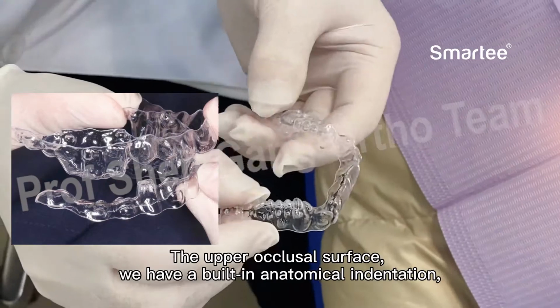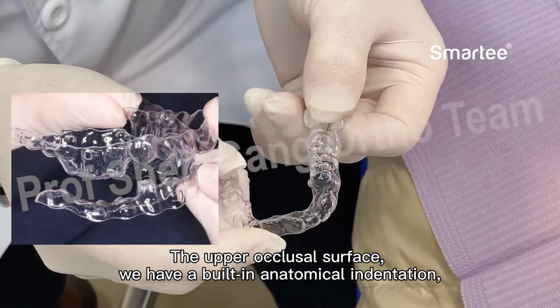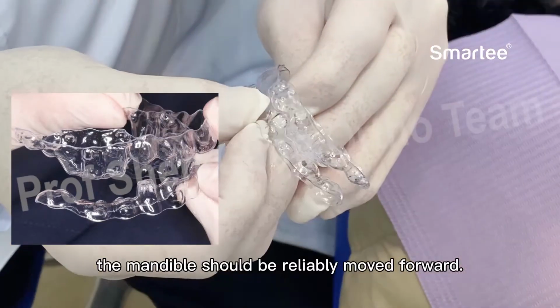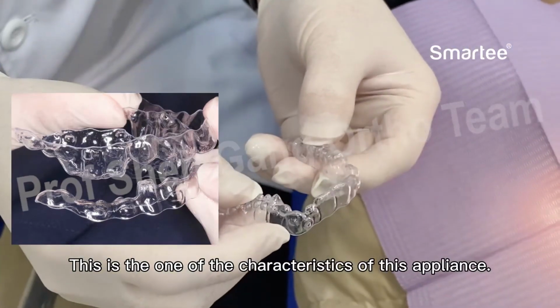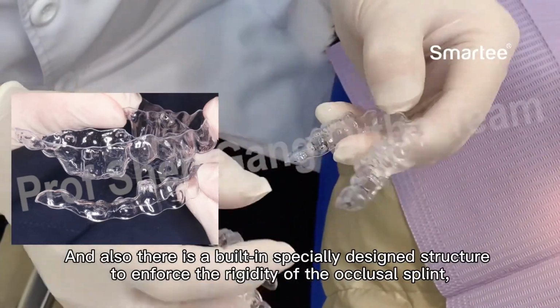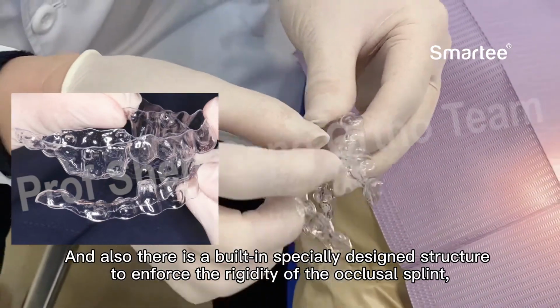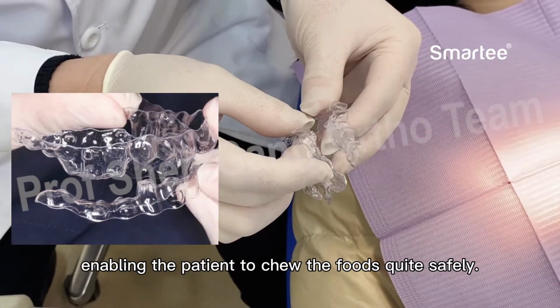On the upper occlusal surface, we have a built-in anatomical indentation. So when the opposing dentition matches to the upper one, the mandible is reliably moved forward. This is one of the characteristics of this appliance. And also we have a specially designed built-in structure to enforce the rigidity of the occlusal splint, enabling the patient to chew food quite safely.